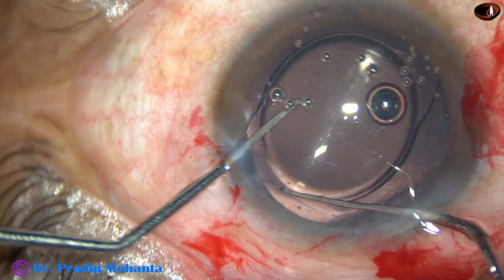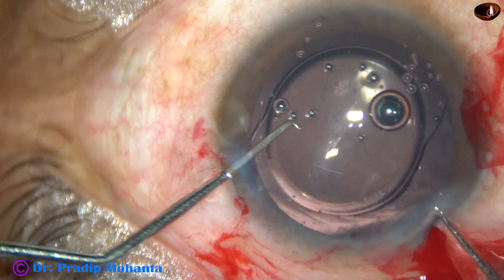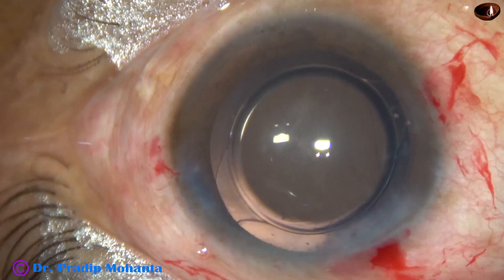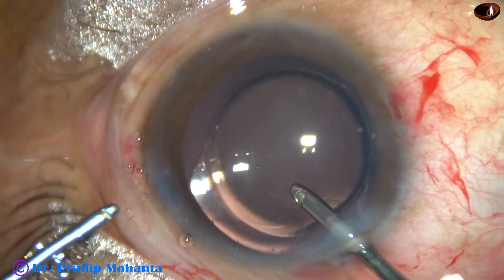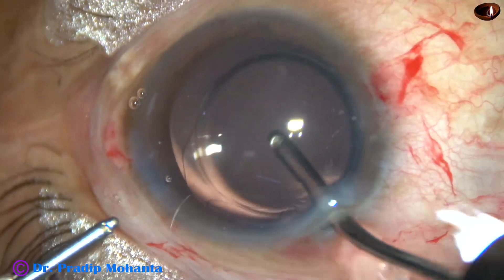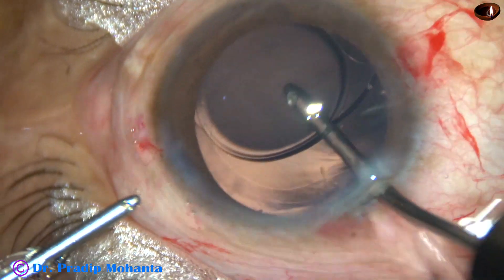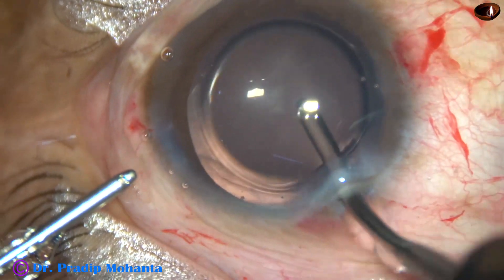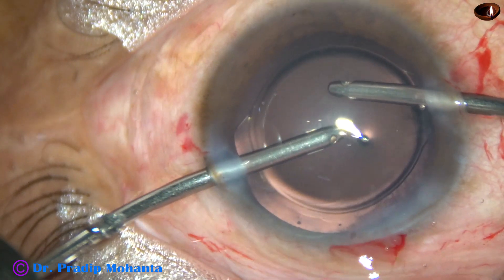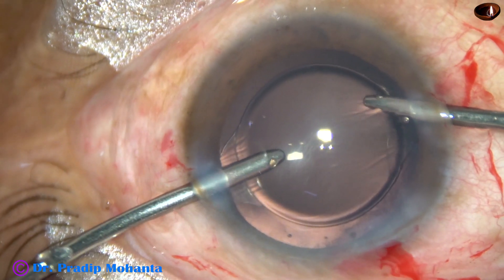Simcoe was used to remove some portion of the visco, and then bimanual irrigation-aspiration is being used. This is irrigation of the anterior chamber — a lot of visco comes out just by irrigation. Going behind the lens to irrigate the capsular bag, and then using irrigation and aspiration together. Thorough removal of visco is necessary to avoid post-operative rise in visco-induced IOP.